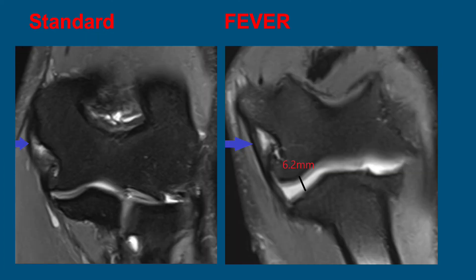Here's a patient example. This pitcher had medial elbow pain and decreased velocities for six months. On the standard image we can see central signal in the proximal ligament consistent with a chronic partial tear and degeneration. On the right, the FEVER view confirms the central signal over about 50% of the cross section. The ligament is more elongated and there is significant widening to 6.2 millimeters in the FEVER stress view. This patient had UCL reconstruction, confirming significant valgus instability at surgery.